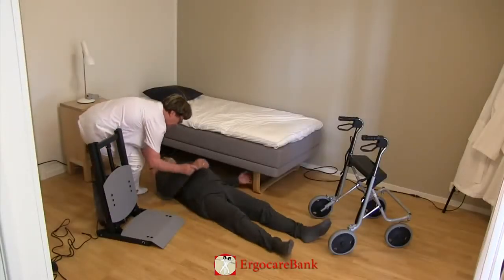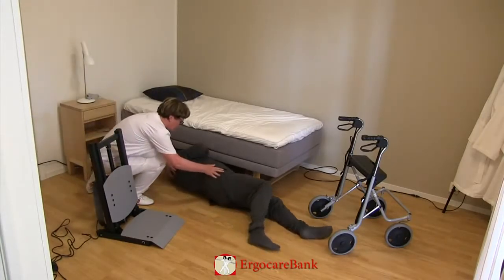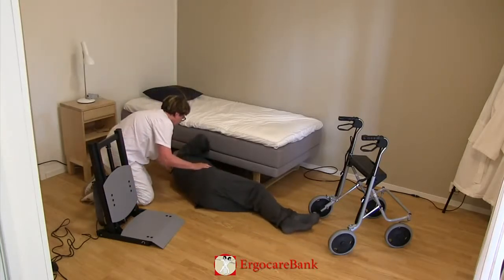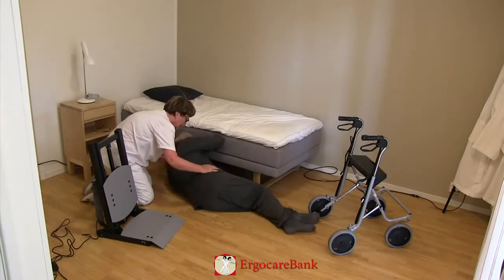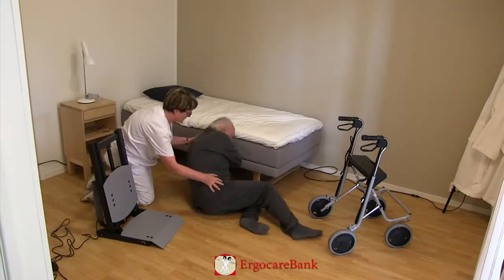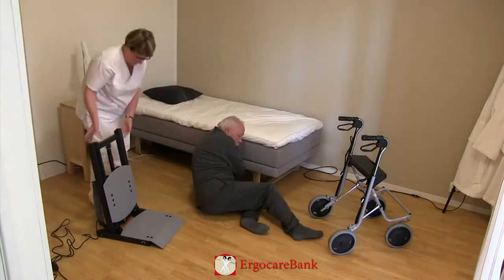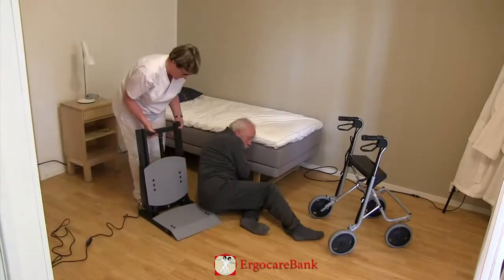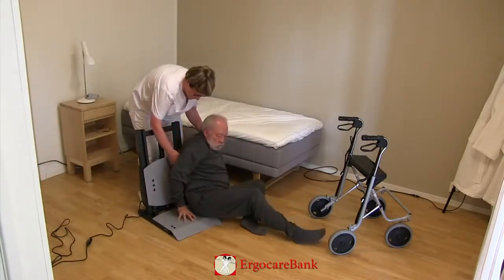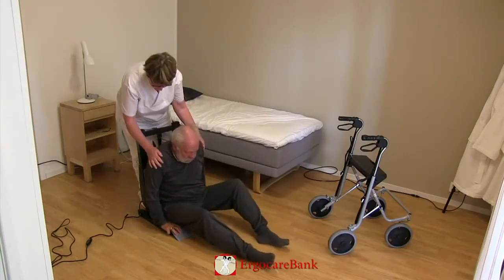Burt is instructed to roll over to the side, pull his knees up, and push himself up to sitting. The staff member puts the seat of the stand-up close to Burt's bottom and instructs him to push himself up onto the seat.